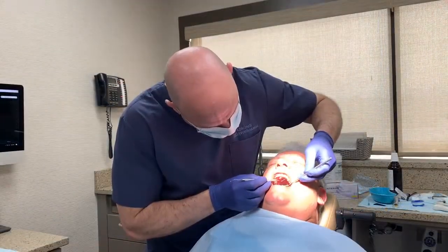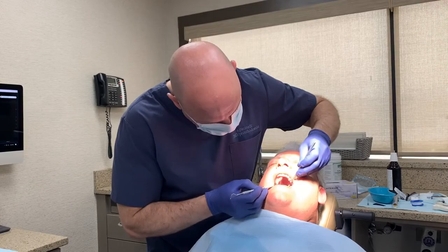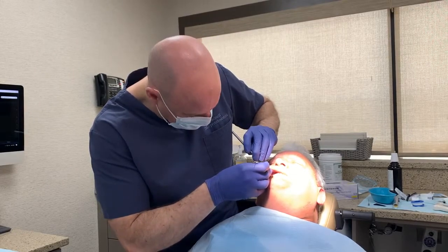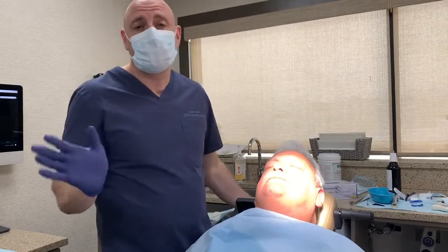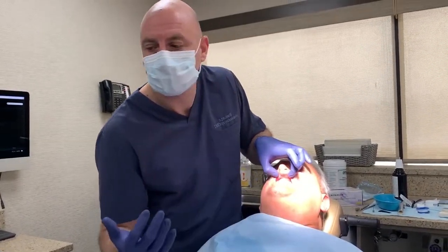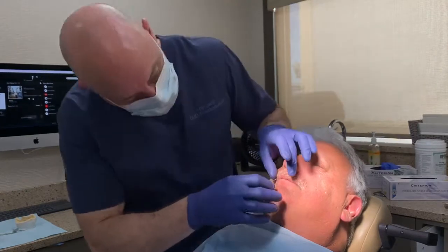So what I'll normally do is take like a floss. I'm doing it with basically a probe. I'm feeling if there's just a little bit of room to bite. So I'm going to take it out. I'm going to make some adjustments, and bite down again, honey. Now what I'll do is just take like a pencil. It's tight. Open for me.